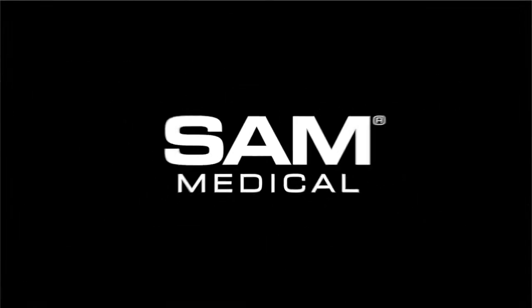Successful SAM-IO access, as with all medical devices, is predicated on quality education and training. This includes comprehensive clinical understanding as well as hands-on skills efforts. SAM Medical is immensely proud to be part of your life-saving work. Our team is inspired by your unrelenting passion and honored that you trust us to support your patient care.